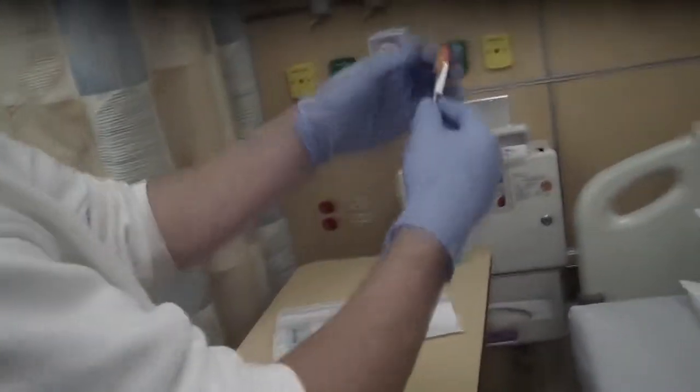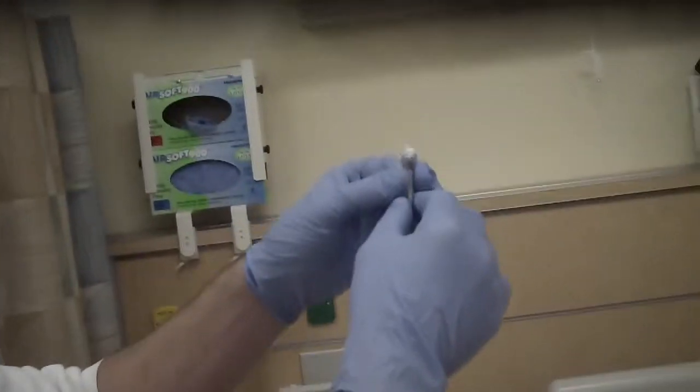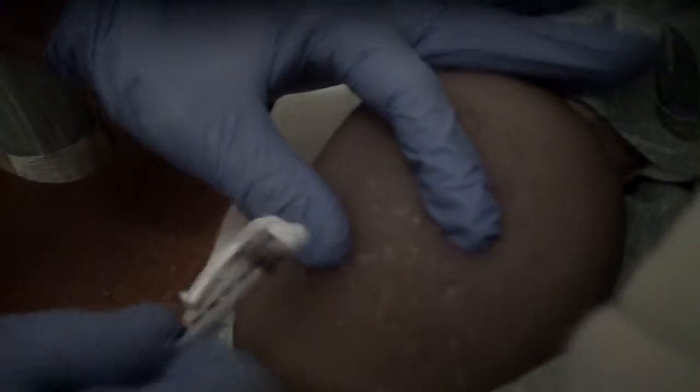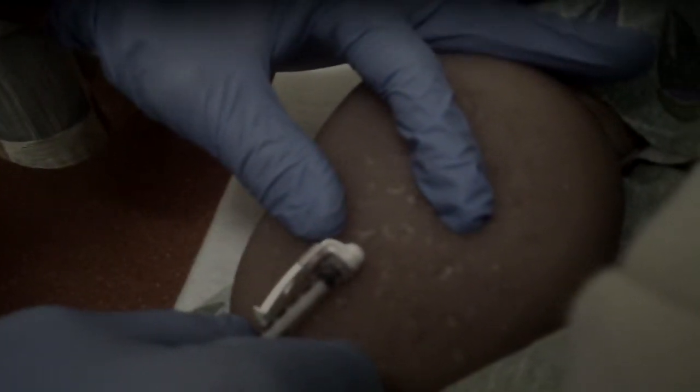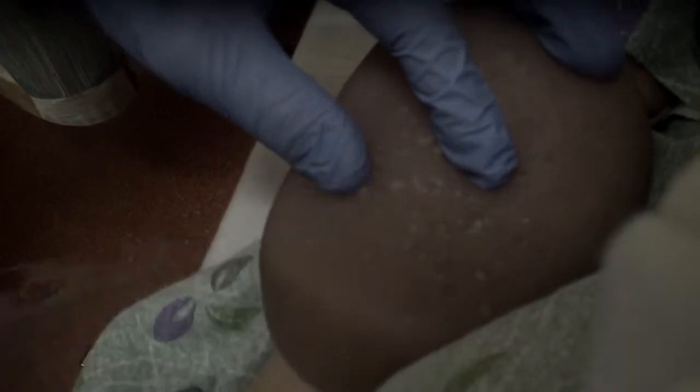I will uncap my needle, discard in the sharps container. I will look for the bevel side. I have my injection site. I will clean that with an alcohol swipe in a circular motion. I will allow that to dry. I will then make the skin taut, inject or insert at a 5 to 15 degree angle, about 1/8 of an inch. Inject, look for a wheel, pull out, discard in the sharps container.